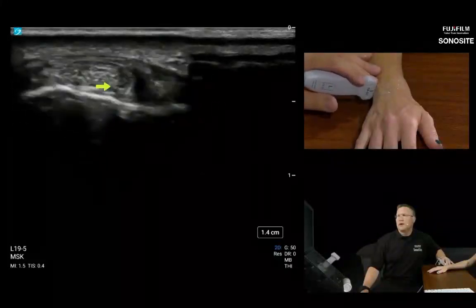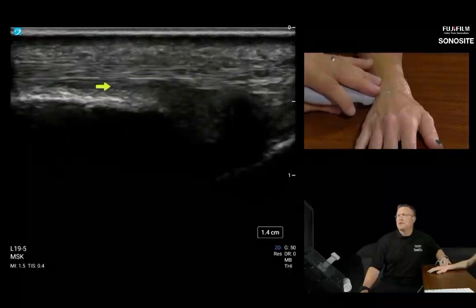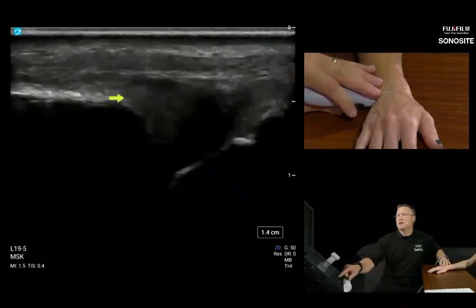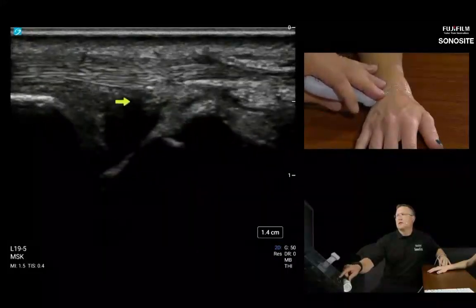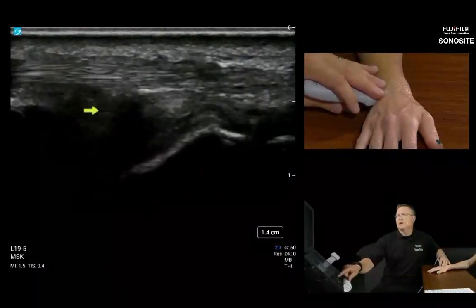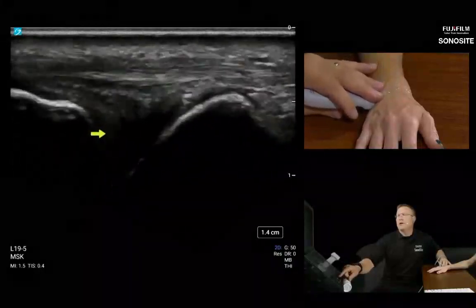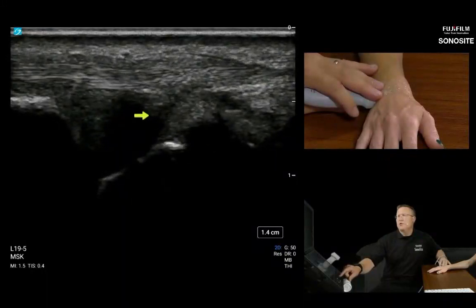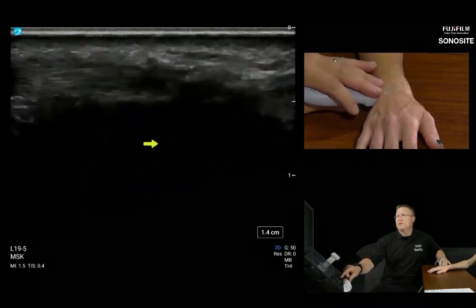So I'm going to go long axis by just spinning on that tendon. I'm now mid-coronal, and I see the ECU in long axis, distal ulna. Here we see the TFCC, which is not talked about in this talk. It will have to be saved for another talk over fibrocartilages, because there's a lot going on with the TFCC.